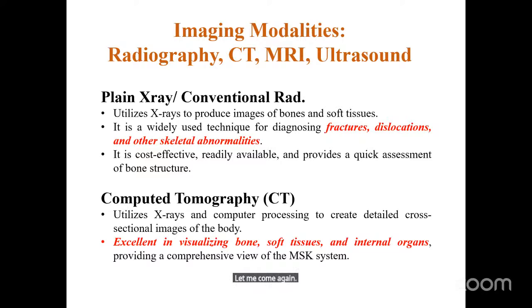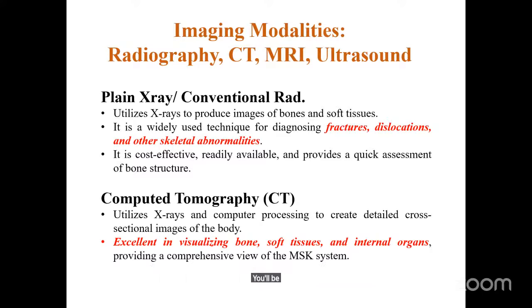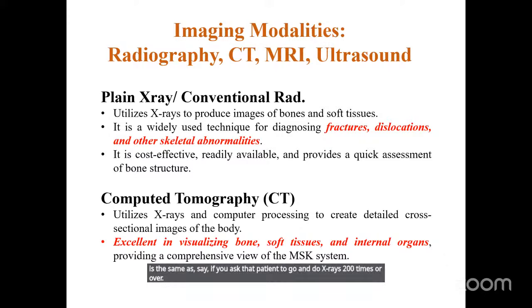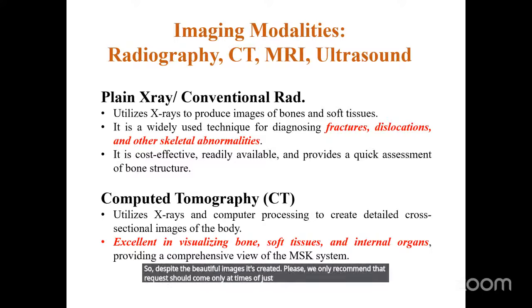The amount of radiation dose you give to a patient when you recommend one CT exam is the same as if you asked that patient to go and do X-rays 200 times or over. So despite the beautiful images it creates, please, we only recommend that requests should come at times of justifiable need.